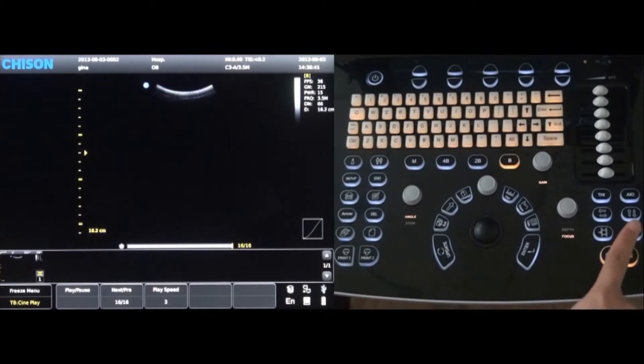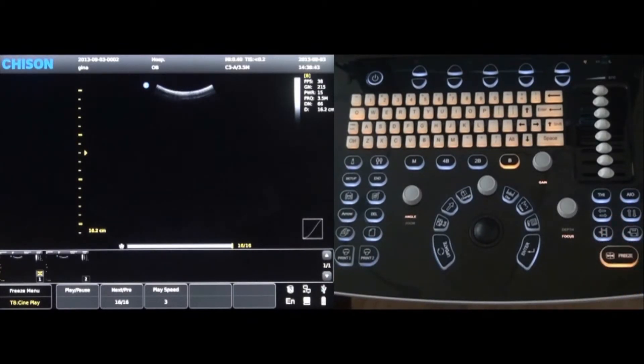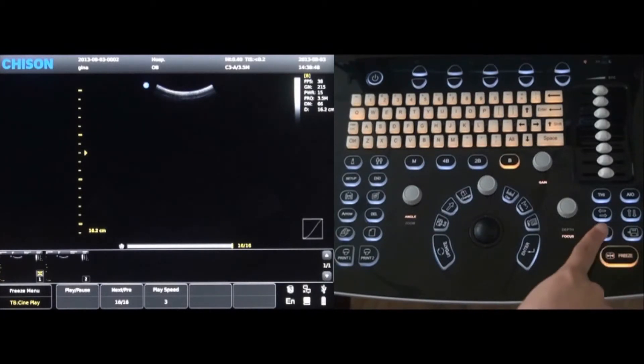To save an image quickly, press the save key. To save a cine loop, press the cine loop key next to the save key.